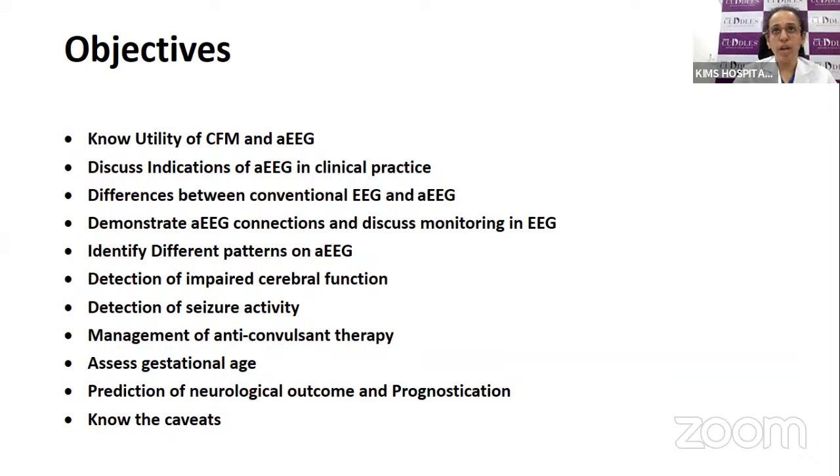With the non-invasive electrodes, the hydrogel and the impedance we should observe, and the contact period should be properly maintained, and the artifact should be noted down properly to differentiate it from the seizure, as well as from any abnormal movements in the aEEG related to artifacts like baby movement or administering a medication, nebulization, suction. And continuous EEG monitoring is required in cases of seizures which come intermittently.